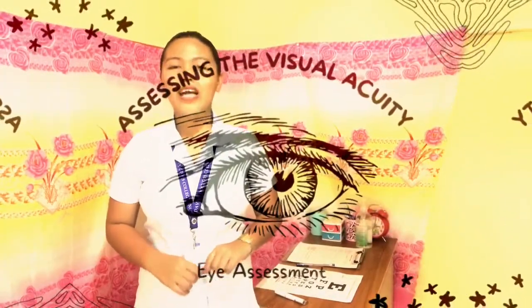Assessing the visual acuity. This is an eye exam that checks how well the patient sees the details of letters or symbols from a specific distance. We let the patient stand 6 meters away from the Snellen chart and ask her or him to read each line until she or he cannot decipher it. Let's just assume that she is standing 6 meters away because there is no available space. So, Ma'am Lynn, can you remove the glasses that you're wearing?